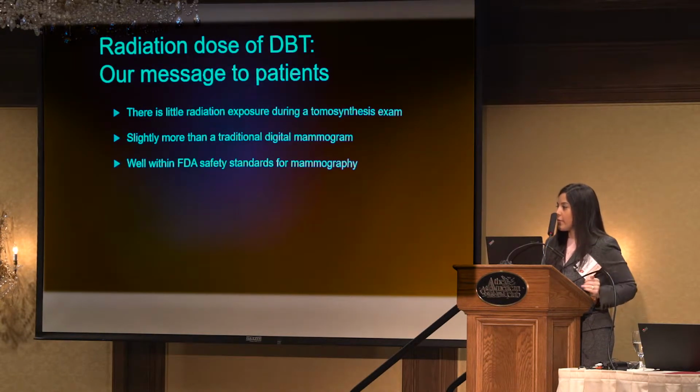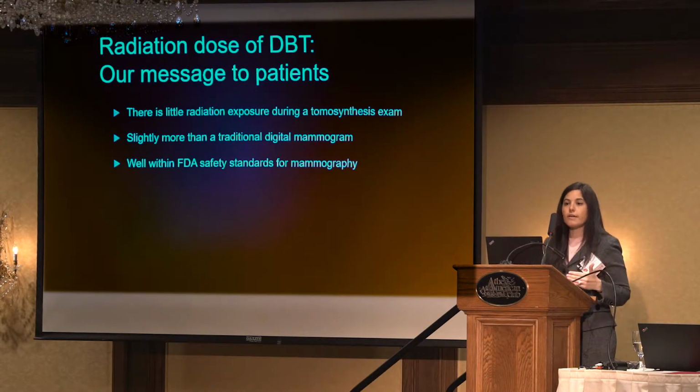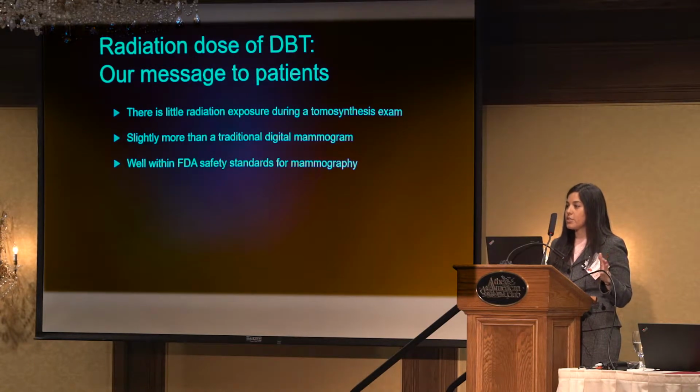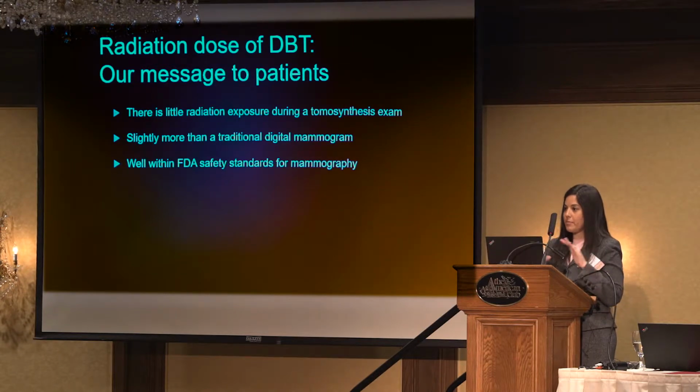It's confusing for patients. We initially were telling patients, oh, you may be exposed to a little bit of extra radiation, but it's well within safety standards, and patients would get confused and would cancel the tomosynthesis exam. So we've simplified our messaging to our patients to say that there is very little radiation exposure. It may be slightly more than a traditional digital mammogram, but it's well within FDA standards for mammography, period.